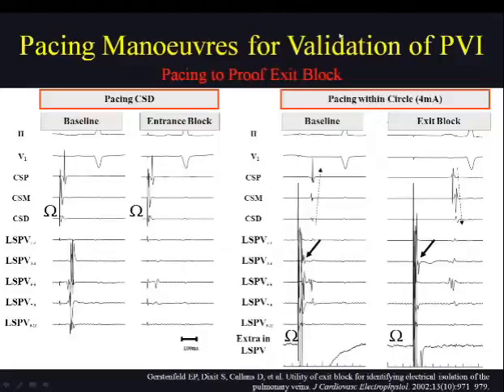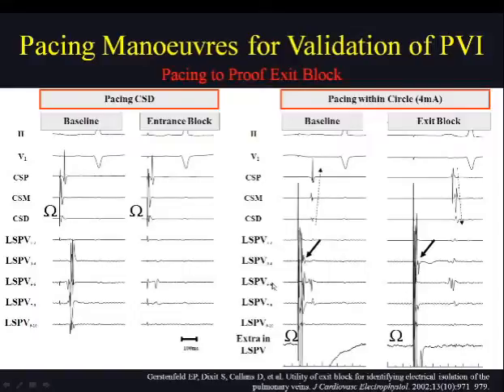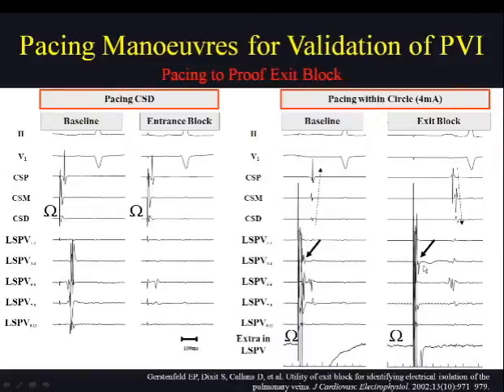In conclusion, differential pacing maneuver is extremely useful, especially during PVAC catheter procedures. Exit pacing is another maneuver in which we pace within the encircled region with an extra catheter or the PVAC catheter itself. Exit block is shown if pacing within the circle captures the PV sleeves but there is no conduction to the rest of the atrium, which remains in sinus rhythm. This pacing maneuver will be discussed in detail by my colleague.